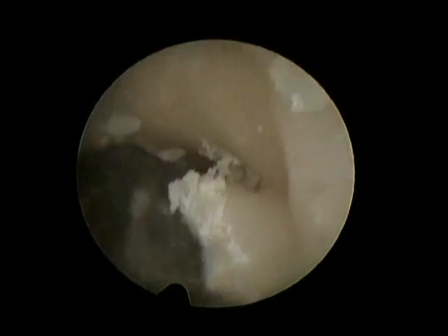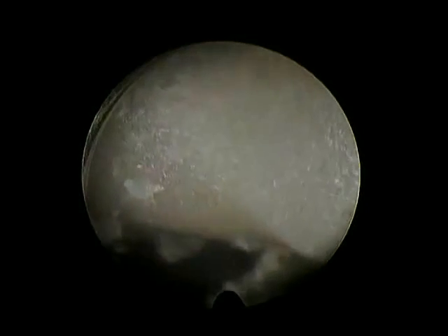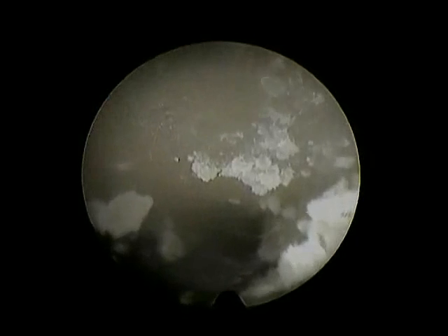Notice the triangle. Now we want to put it at 9 to see what's happening at 3, the left ostium, but we cannot see it because of that big mass here. This big polyp makes it impossible for us to visualize the left ostium. So what do we do? We move backwards a little bit. We can't see the ostium, so we try to go through between the polyp and the uterine wall. We put it at 6 too, and we penetrate this part.